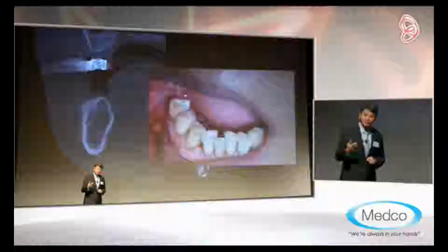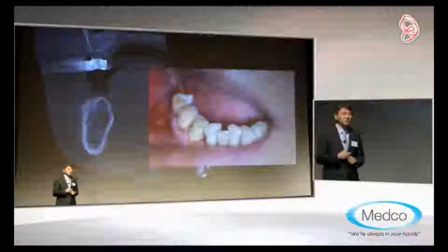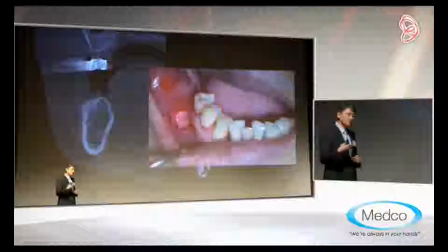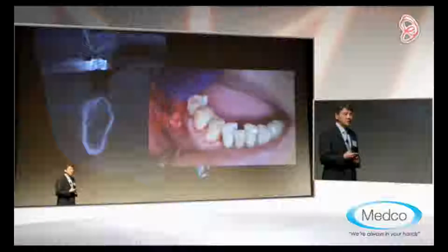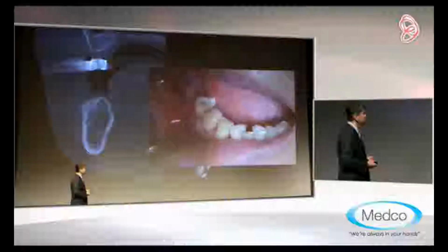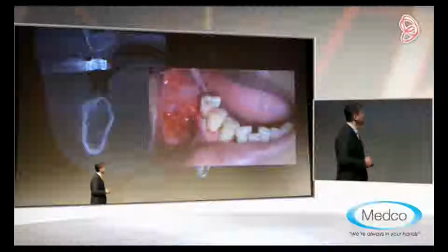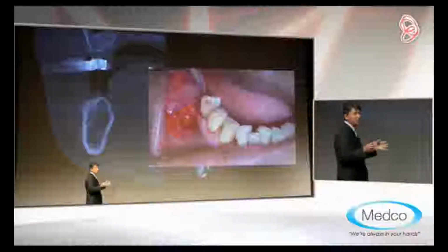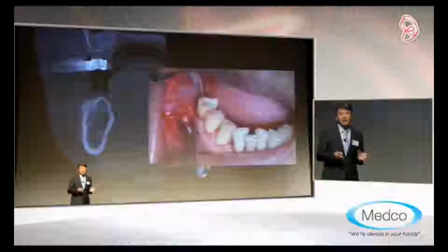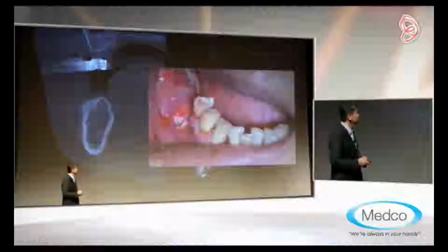I highly recommend to use syringe. We use diabetic syringe to insert the bone, because when you use the spoon, there's higher chance to get infection from the saliva. So it's very important to use diabetic syringe and inject the bone with just one shot. And we will pack it around, make sure there's no dead space, and we will suture, and patient is done after 15 minutes of short procedure.